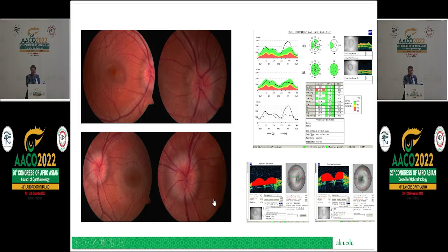So what is happening here? Is this papilledema? Is it something else? What clues can you get? Well, first of all, it's a tough case, right? Because the disc margins are quite blurred. So it could be papilledema, it could be something else. However, the fine blood vessels on the disc are still pretty good. Because usually if you have this much swelling, those small blood vessels are not visible, right? So I wasn't convinced that it was papilledema. And the other thing is that the nerve fiber bundles are quite thick. And when you look at the disc, it has rather a lot of protrusion from the disc.